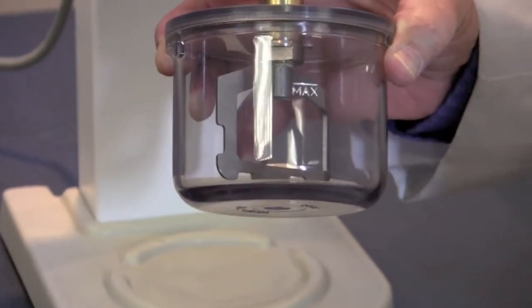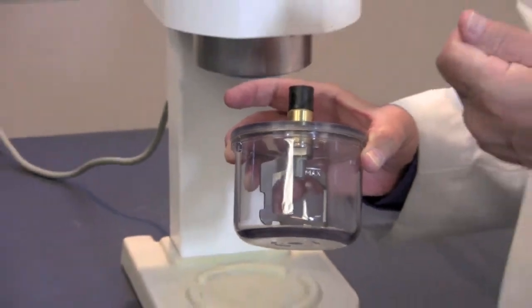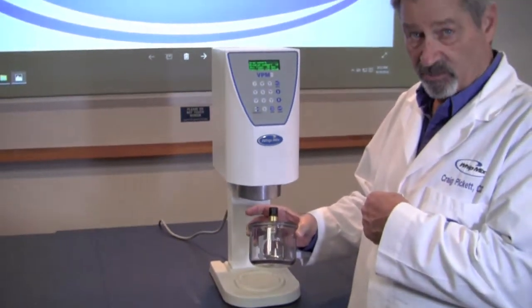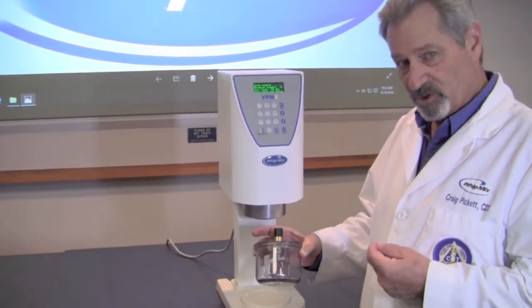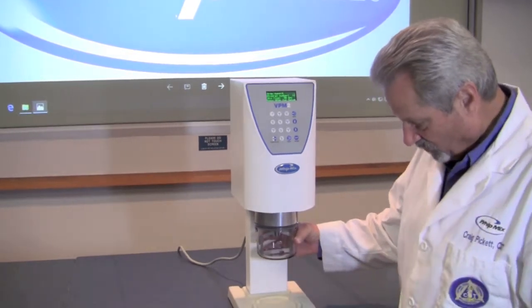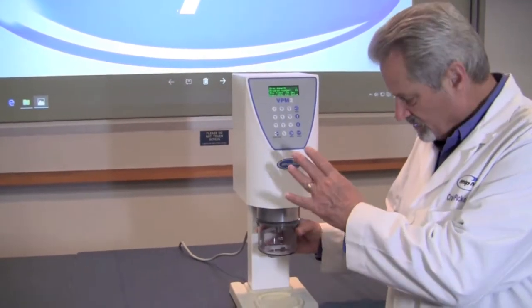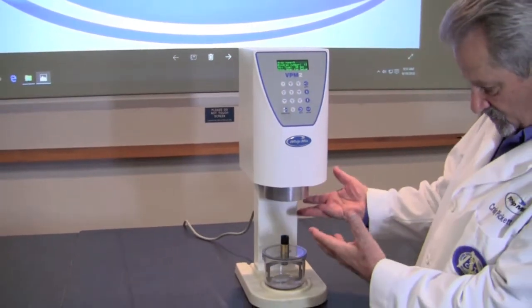If we do, we run the risk of having the mix or the water pulled right up into the vacuum machine. On the old machines you could see it going up the tube and you knew immediately, but now that we use a machine that uses the vacuum to hold the bowl, we don't really see it. So let's talk about what happens when that gets sucked up into the machine.